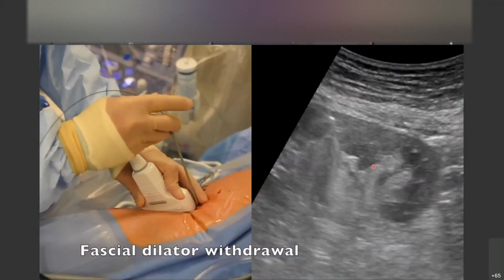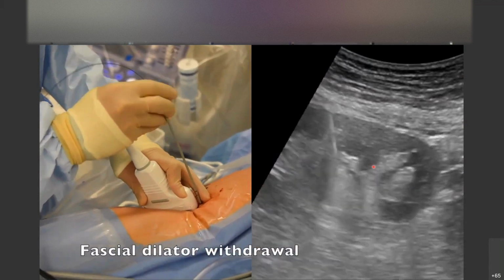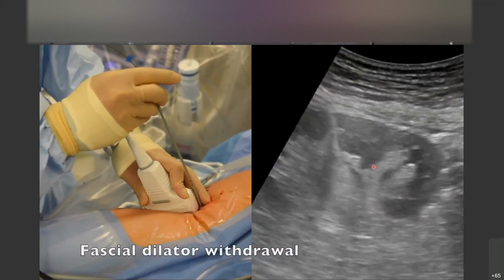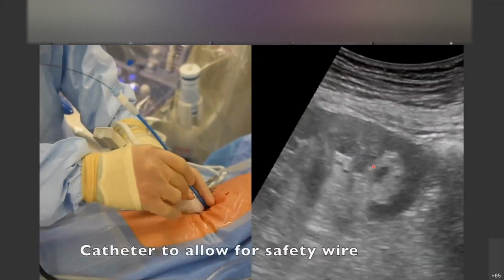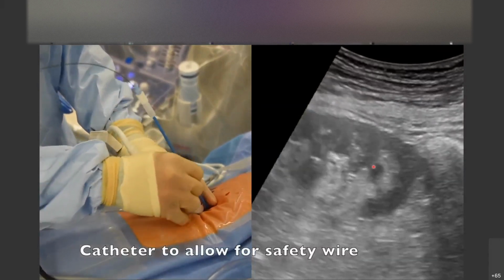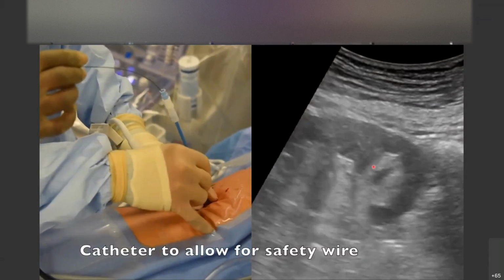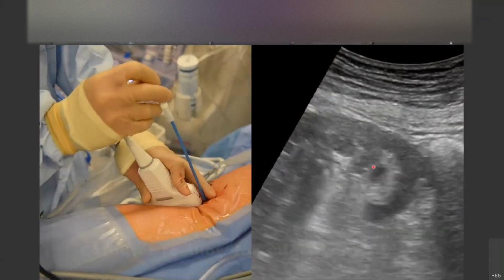We back off the fascial dilator, maintain control of that wire. See that he pinches it here. Now, the dilator actually is not really visible on ultrasound, so you'll see that the wire disappears, and that's how you know how far in you are. So you can kind of see the tip there, but again, it's not really visible. What you're looking for is the disappearance of the wire.